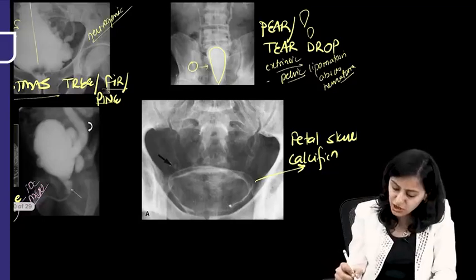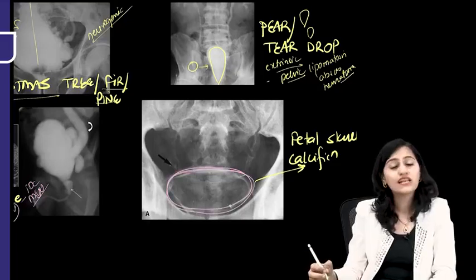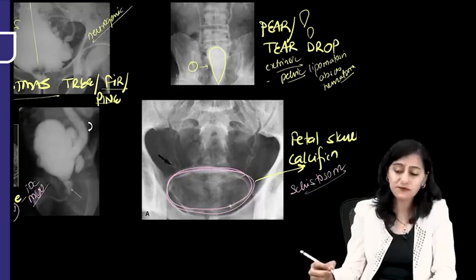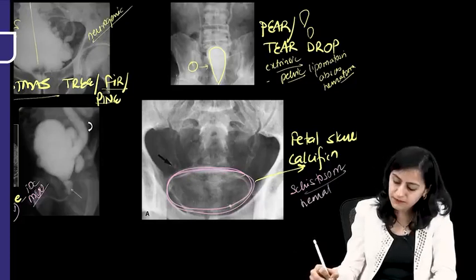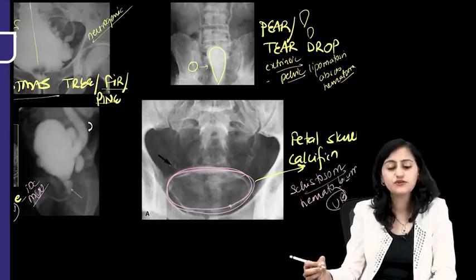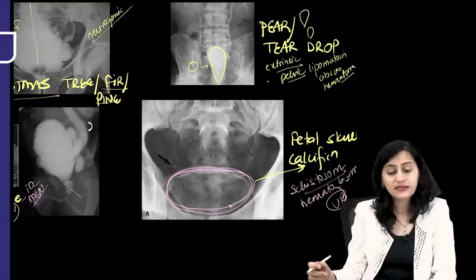This image is showing the calcification of the bladder wall, and this is seen with schistosomiasis. Which schistosoma in the bladder? Hematobium. Okay, it is Schistosoma haematobium. The U and the B, that is urinary bladder. It can cause bladder cancer.